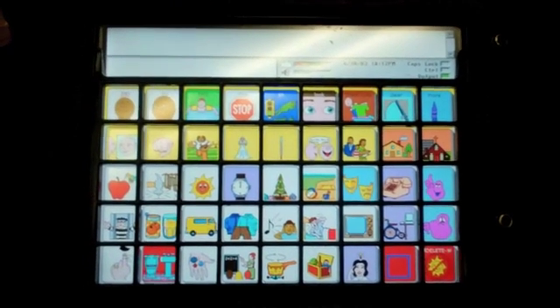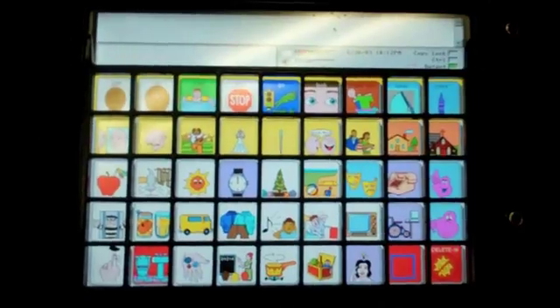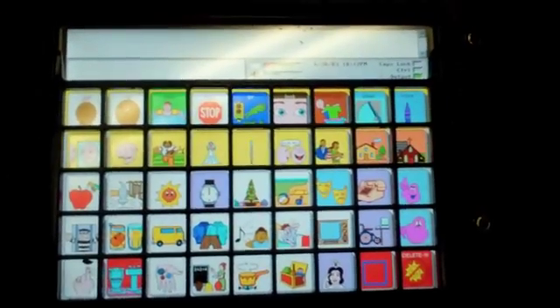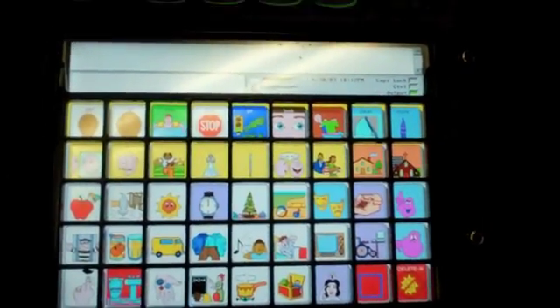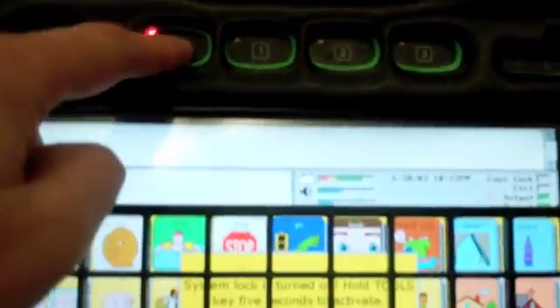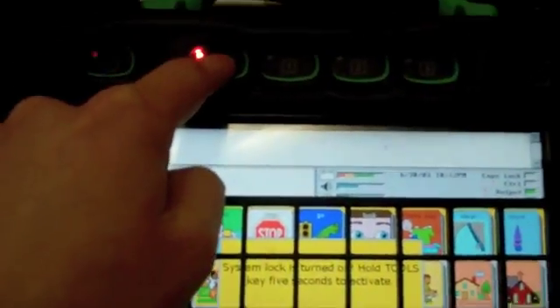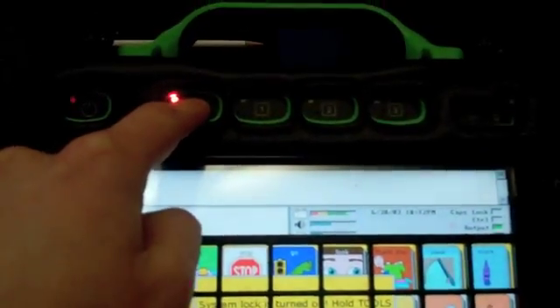Okay once you've turned it on, and if you would like to change the volume, you can go to the Tool setting and click, and right now our system is locked, so you have to hold for five seconds.